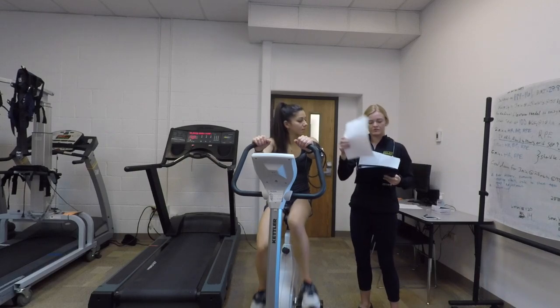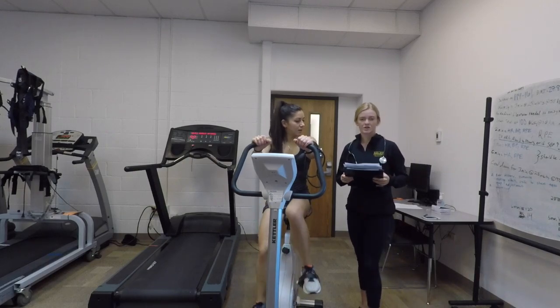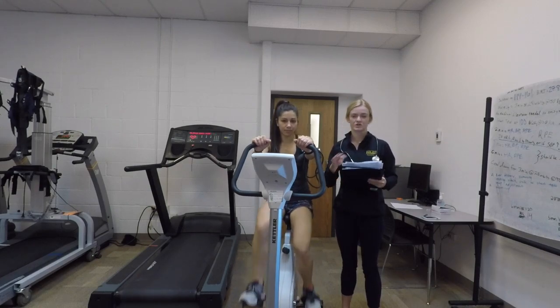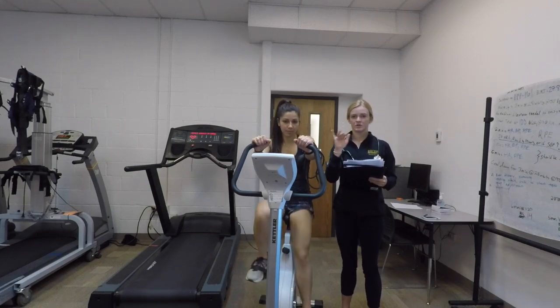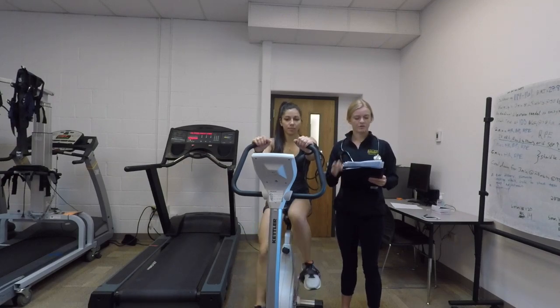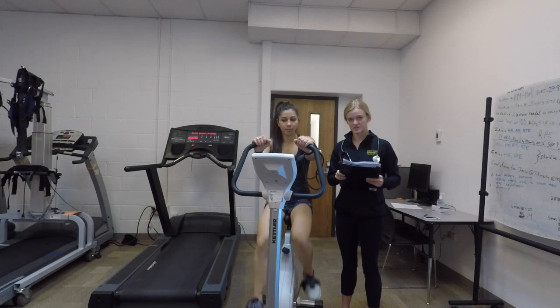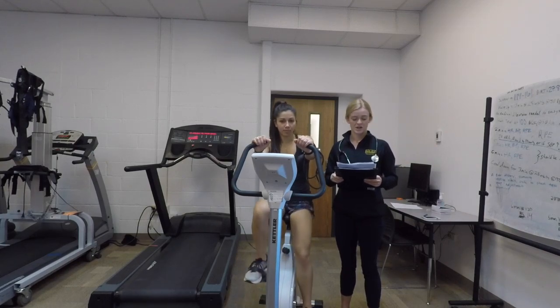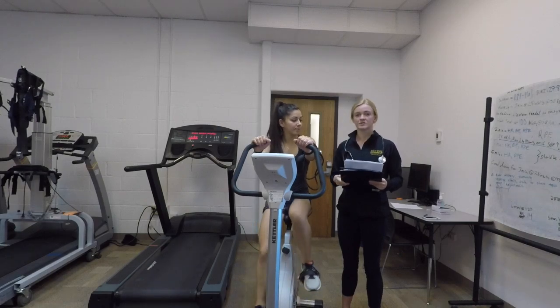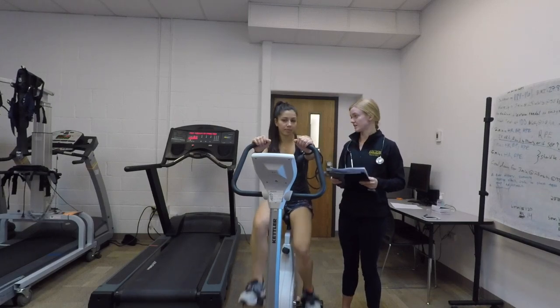So both of her vitals were what we would expect. Her systolic pressure raised slightly and her diastolic blood pressure just didn't really increase at all, kind of just fluctuated slightly. So as a result, it is safe to continue with this test. We have no reason to stop. And in a couple minutes, I'll take your vitals again, but this time we'll take heart rate twice to make sure that you are at steady state.